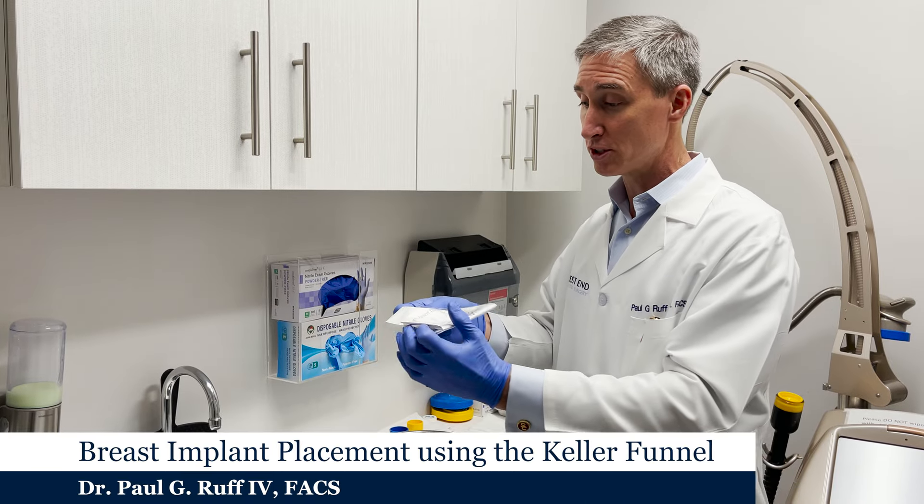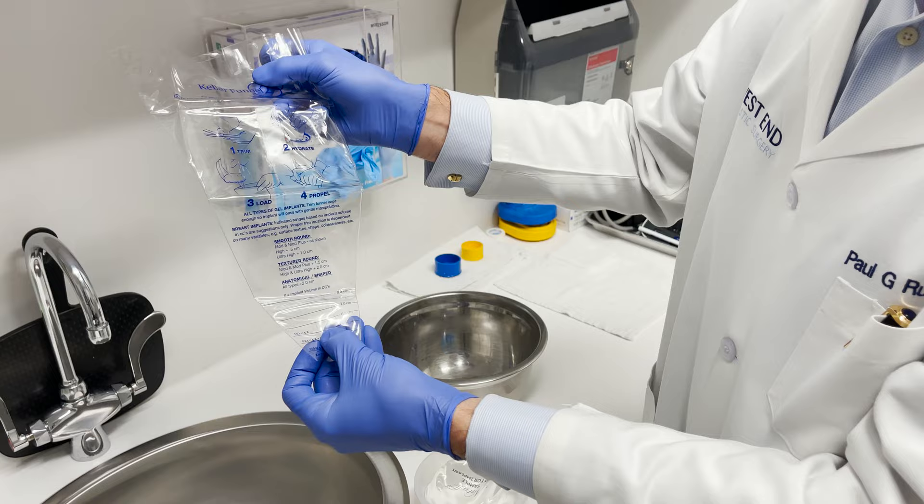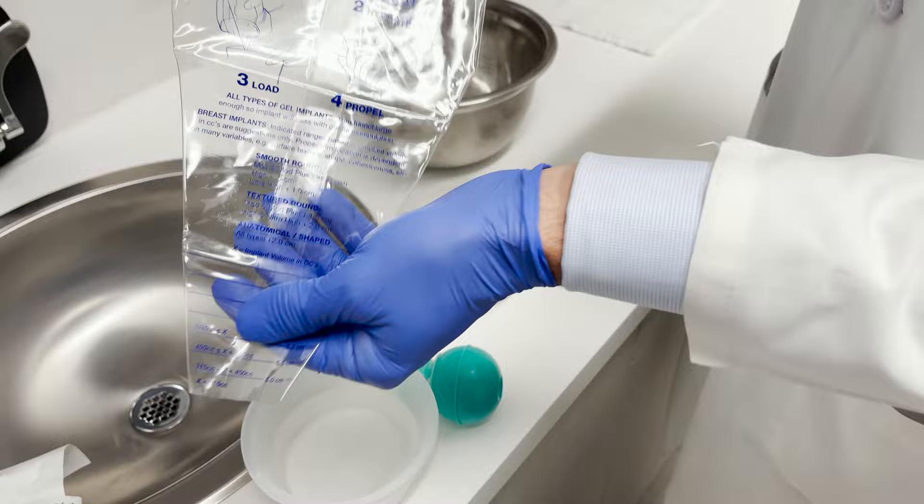This is pretty simple and straightforward — it is a funnel just like this. It has little gradations on it for different size implants, and we place this inside the incision. It'll go inside the incision, and we lubricate the funnel.